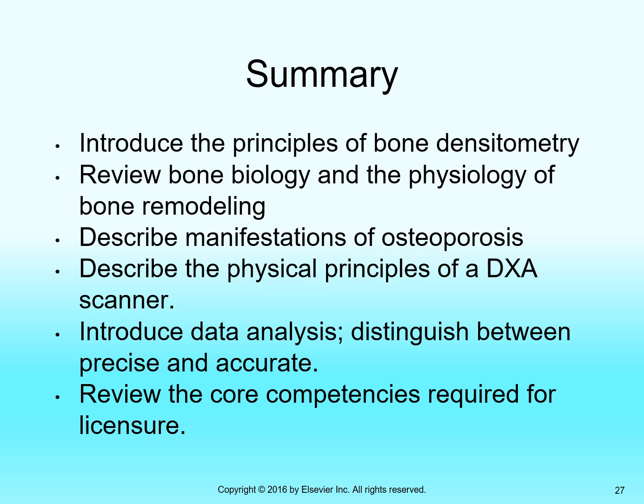Densitometry usually is following osteoporosis, which is a chronic condition, so there are follow-up bone densitometry studies done periodically, either annually or semi-annually, to monitor the progression or the effective slowing down of the osteoporosis with prescription intervention. And so we need follow-up studies done for our osteoporosis patients.